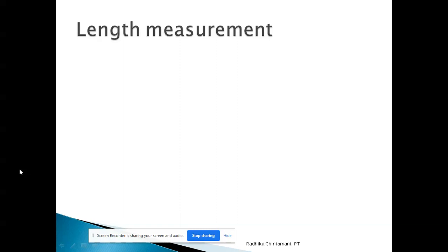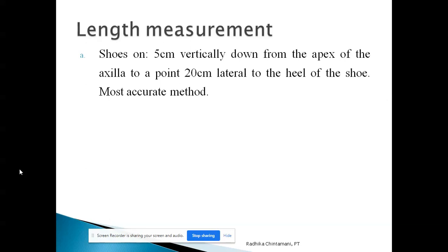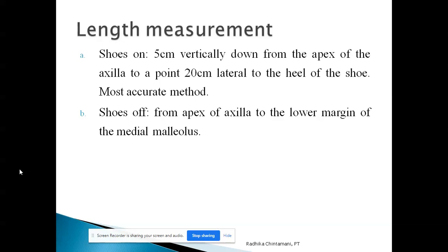For length measurement of the axillary crutch, there are two types: shoe on and shoe off. Shoe on means the person is wearing the shoe when measuring, shoe off means they are not. If the person needs to go out of the house for longer durations, shoe on measurement is taken; if restricted to daily home activities, shoe off is used. For shoe on, measurement is taken five centimeters vertically down from the axilla to 20 centimeters lateral to the heel of the shoe — this is the most accurate method.